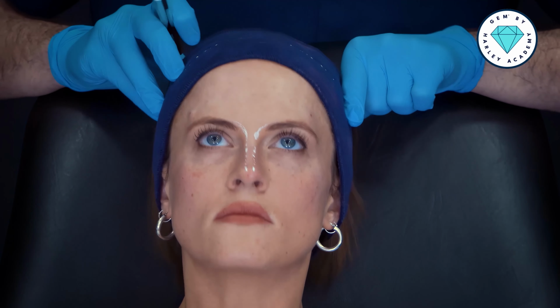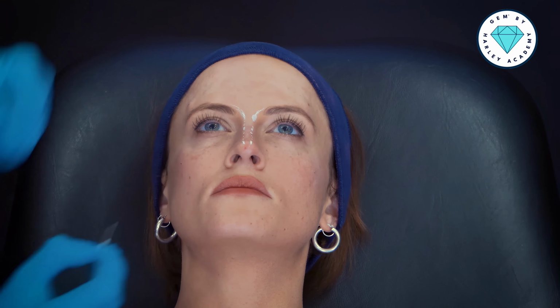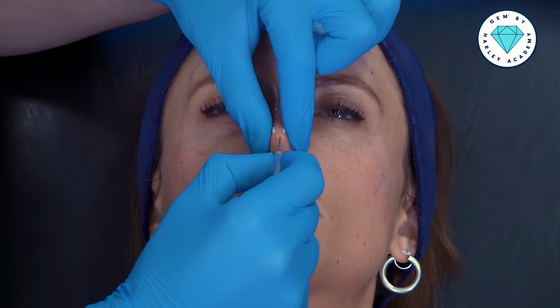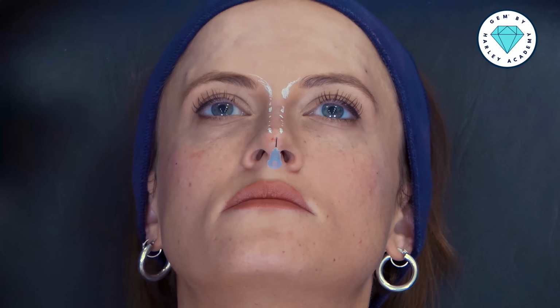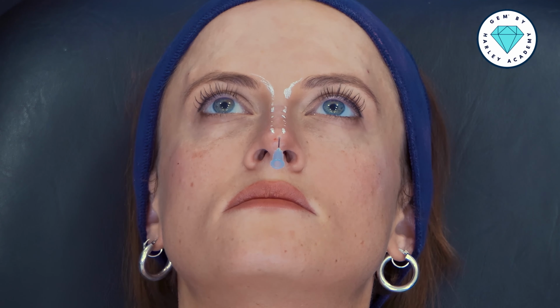Head back. So let's keep those lines on. I'm going to make my entry point now into the tip of the nose, just through the skin. This, again, I'm going to leave in the nose for 10 seconds to make sure I haven't cannulated an artery.